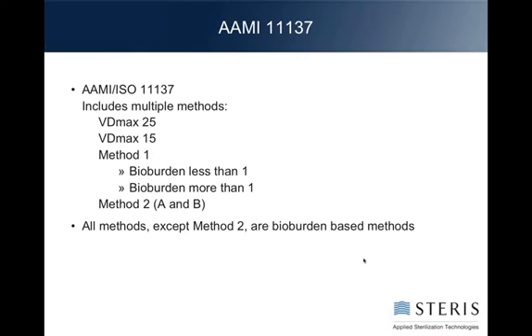Okay. We're going to look in detail at that 11137, and we're going to start with the methods that are in it, particularly Method 1, the Method 2s, and the first and most common VDmax methods.